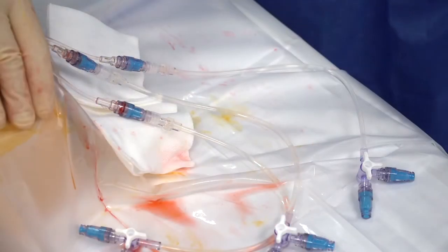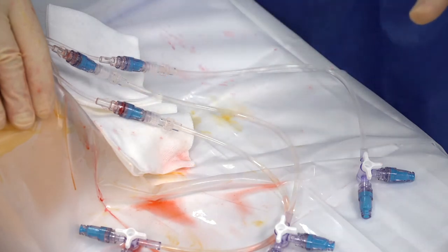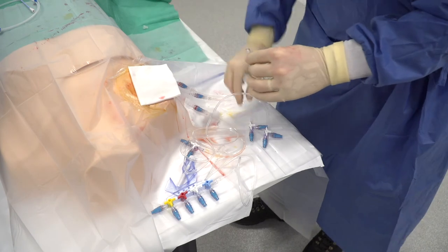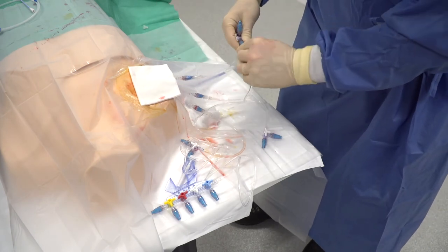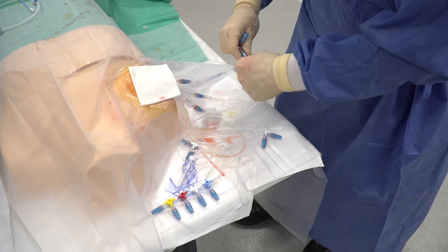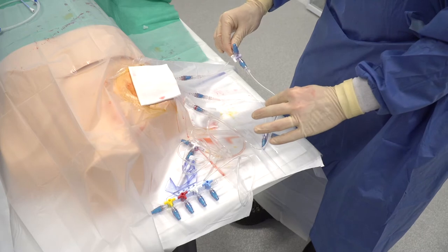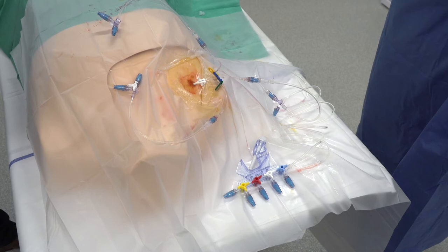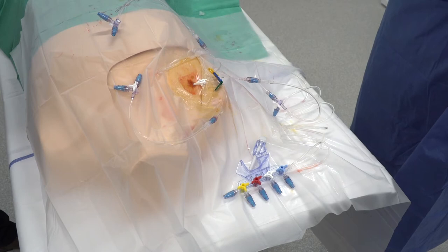These three connectors are the proximal connectors. Screw the extension of the four-port manifold into one of the connectors of the three-way stopcock of the distal line. Now all of the connectors are set up on the catheter and the catheter can be used.